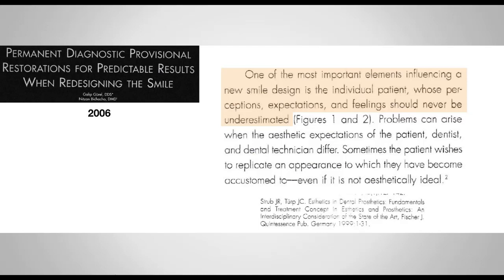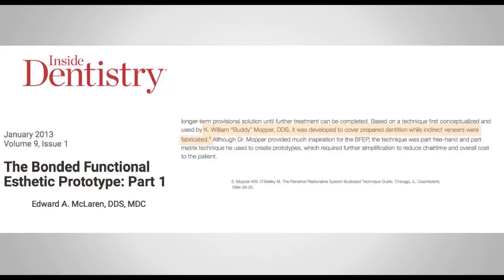So now you are involving them. You're not underestimating their decision making; you're actually involving them in that important decision. This is what we're looking to achieve. Do you like what I'm planning for you? Do you like the shape of your teeth? Do you like the textures that we've created? Do you like the incisal embrasures? Do you like everything that I've been able to work through your system and now put in your mouth and send you home with, so that you're able to function with it as well? So this is the idea behind the functional aesthetic prototype.